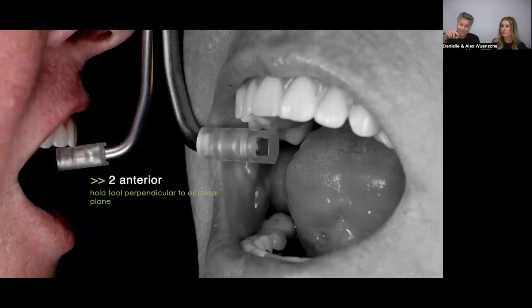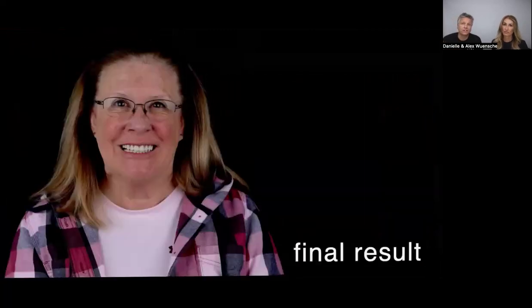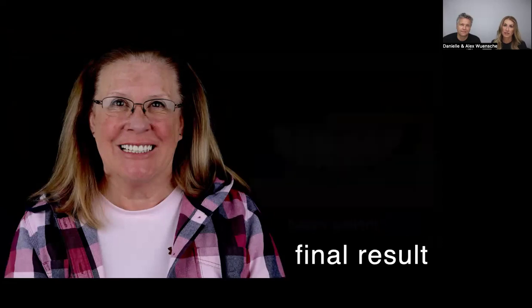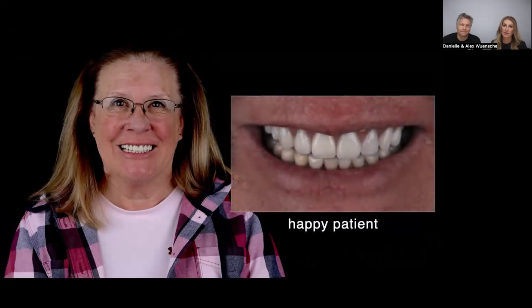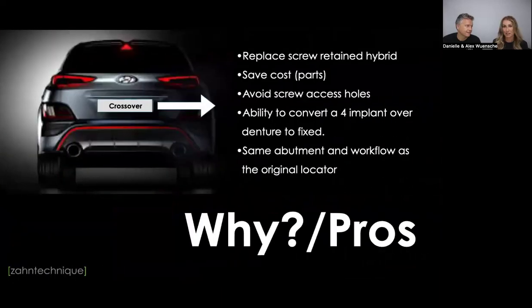You have that lasso, that loop goes underneath the intaglio, and you pull and you click, and it will pull down the restoration. Maybe not very comfortable for the patient, as far as I heard, but there are definitely advantages we're going to go over very soon. And this is the final result for the patient. So she was happy at the end. And I would say it's a great restoration and a crossover between removable and fixed dentistry.